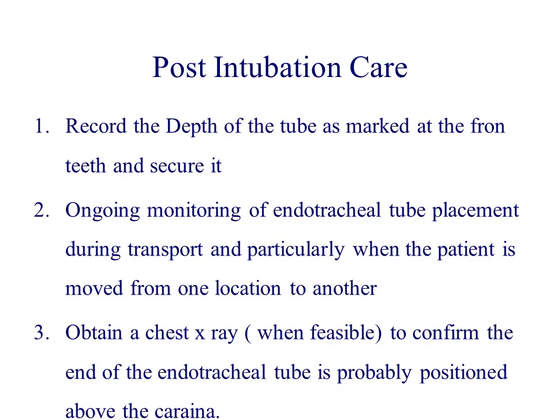Post intubation care: record the depth of the tube as marked at the front teeth and secure it. Ongoing monitoring of endotracheal tube placement during transport, and particularly when the patient is moved from one location to another. Obtain a chest X-ray when feasible to confirm the correct placement.